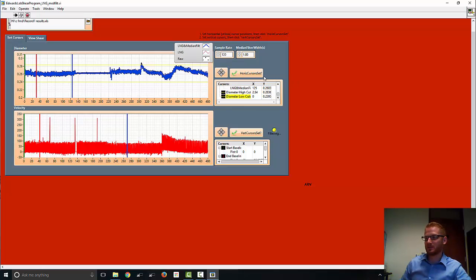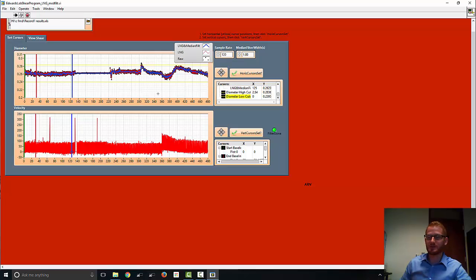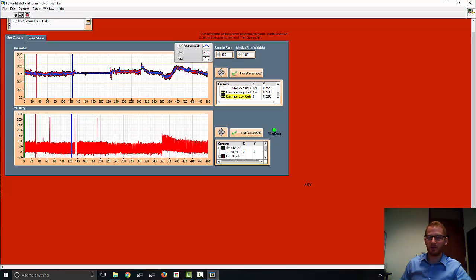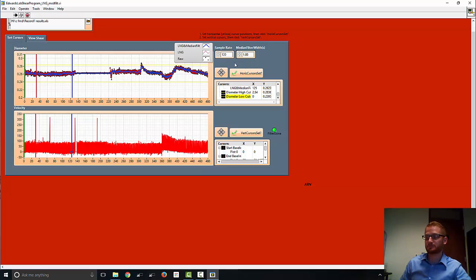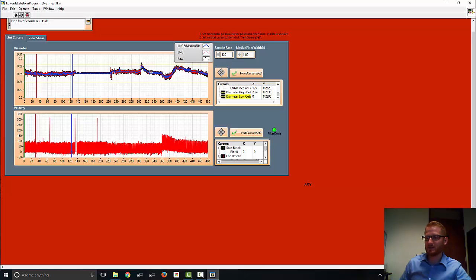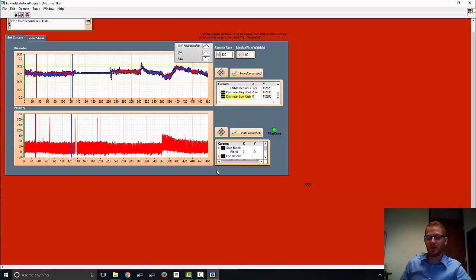And then you want to hit this horizontal cursor set. So the horizontal cursors are those yellow bars that we set by dragging them up and down. So once you're happy with where they are, hit that horizontal cursor set and it's going to calculate the diameter of the vessel moment to moment using just the good data points that you didn't exclude using these yellow bars. And also it's going to be doing a median filter. This right now is set to one second. You can set it to whatever you want. We often use either one or three seconds. But right now, it's set to one. So the data now after the median filter is this blue data. So you can see the line is fairly stable, this blue line. And that's what it's going to use to calculate the flow mediated dilation.